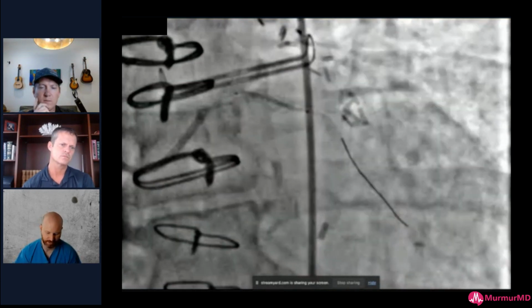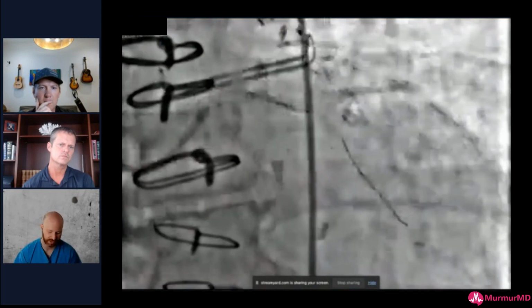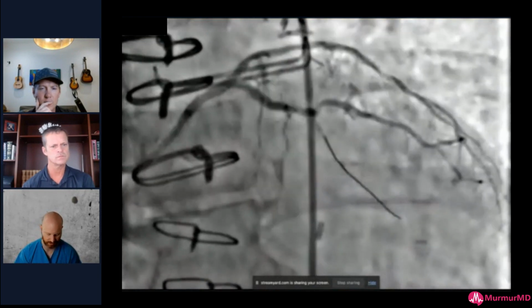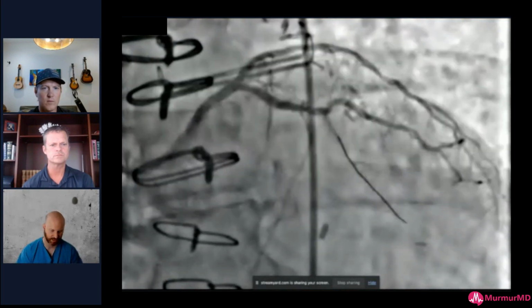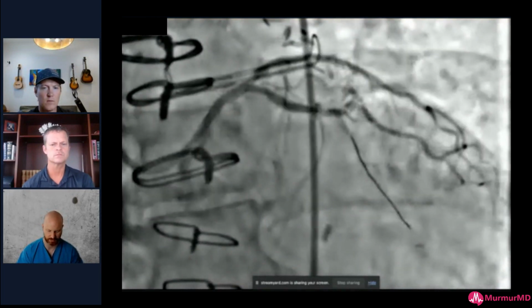Because the balloon, sometimes it'll re-advance through the calcium and sometimes it's a little hard to push around. So I try and put it as far as I can get it, or as far as I want it, with whatever guide extension and support wire I'm going to use. And then I slowly march it back, trying to move it about 1 millimeter at a time, just trying to move those emitters across the nodule of the calcium.